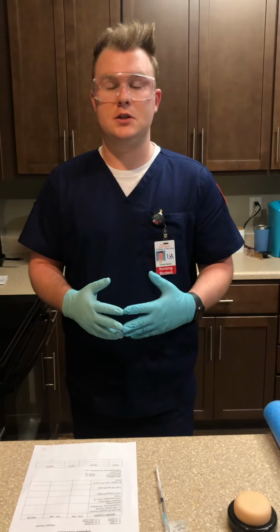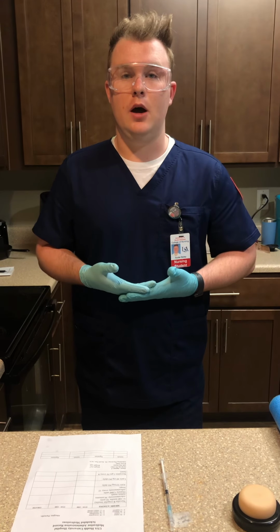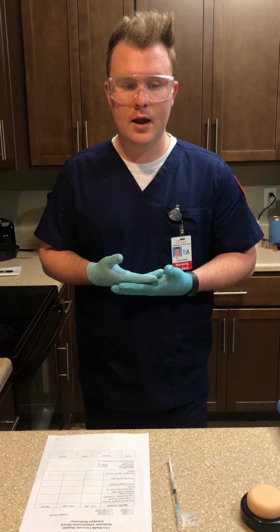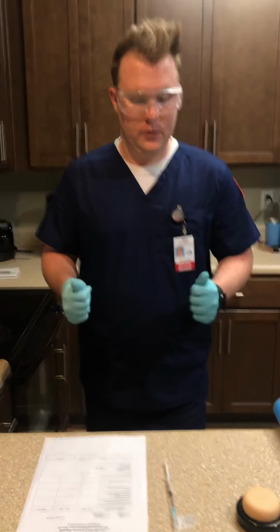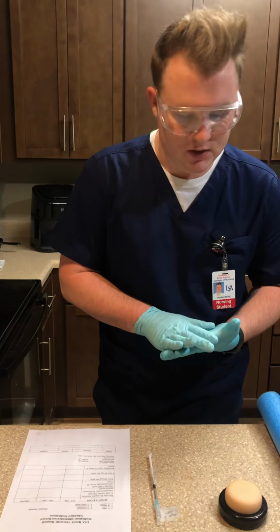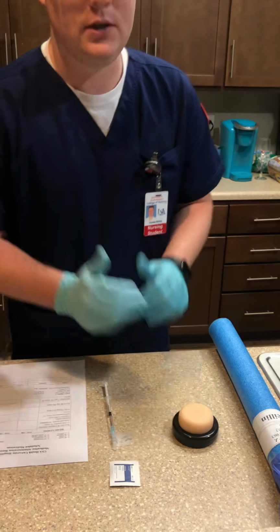I'm going to make sure to stay away, at least 2 inches away from the umbilicus. I'm not going to go above the costal margin. I'm not going to go below the pubic area, and I'm not going to go past the anterior superior iliac spine. Okay. So now what I'm going to do is I'm going to assess for skin integrity and see if there's any bruising, and the skin looks good to go.